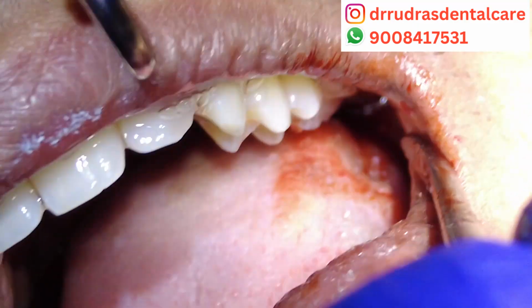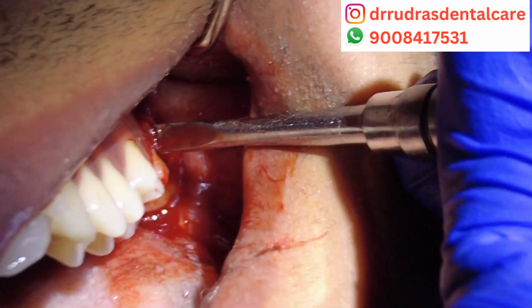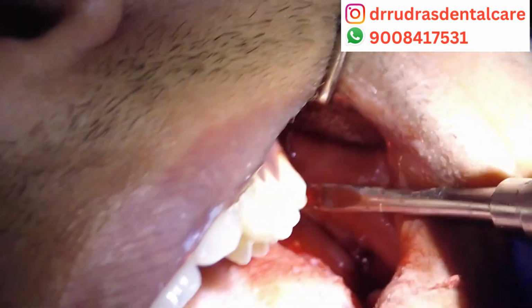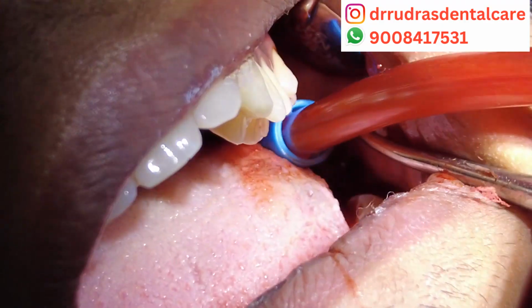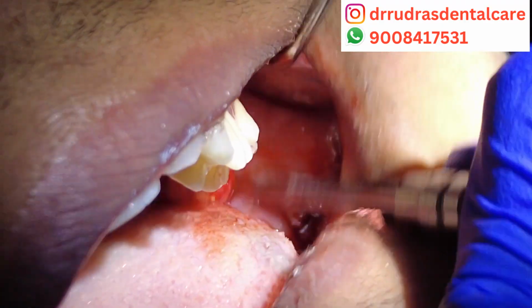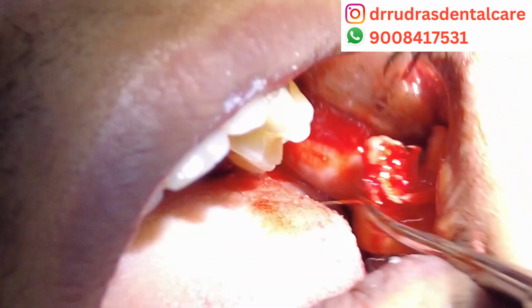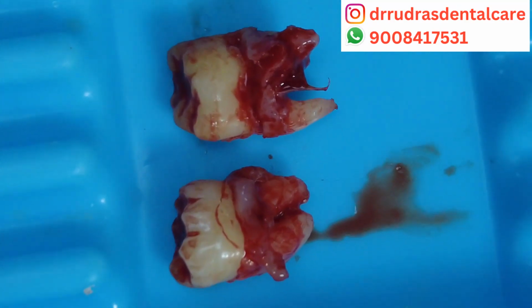Now you can appreciate that the tooth has actually come down, it has luxated out, it's come out of its socket but not completely. So we will further luxate the tooth out, and if required we'll use forceps to retrieve the tooth. Thankfully, the whole tooth came out, and now you can appreciate both the teeth 2/8 and 3/8, which have been taken out in a matter of 9 minutes by our oral surgeon, Dr. Prabhat Sen.